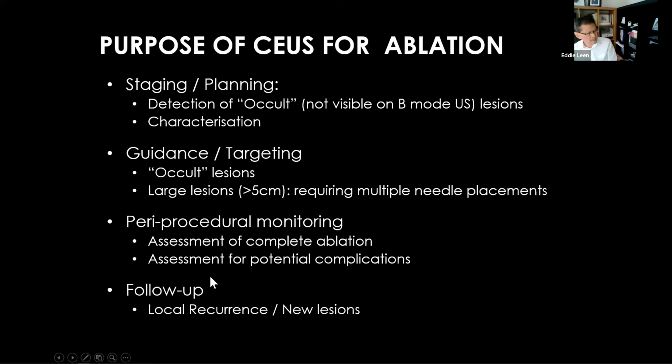And lastly, as a follow-up for looking at local recurrence and also in identifying new lesions, and this applies more so for looking at hepatocellular carcinoma treatment rather than metastasis.